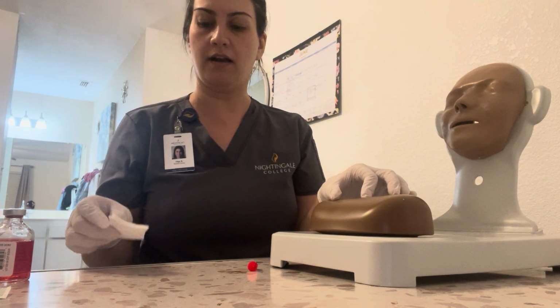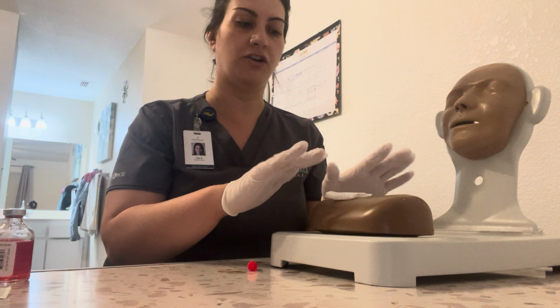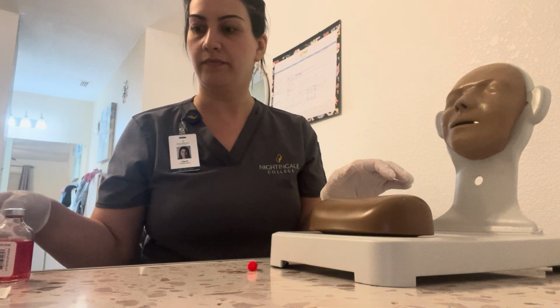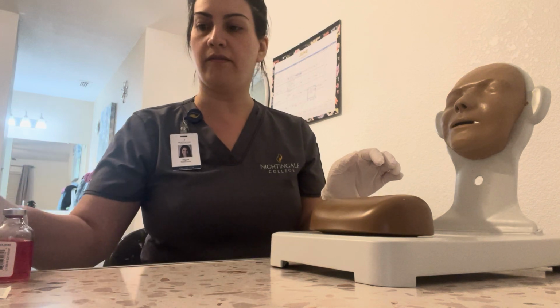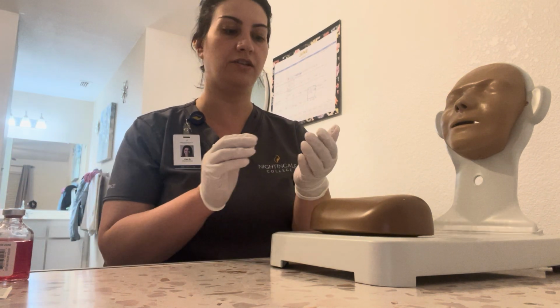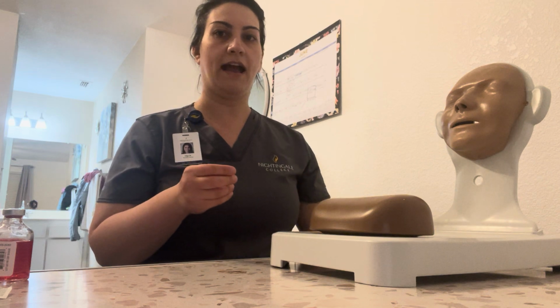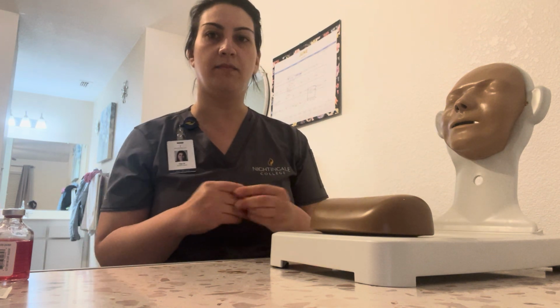We're going to take our gauze pad here, gently, and not massaging it or anything. I'm going to take it out. No sign of bleeding, so no need of Band-Aid. We're going to next discard everything that is needed in the trash, put this in the medication vial. We're going to take off our gloves, throw them in the trash. We're going to hand hygiene, and we're going to document our results.